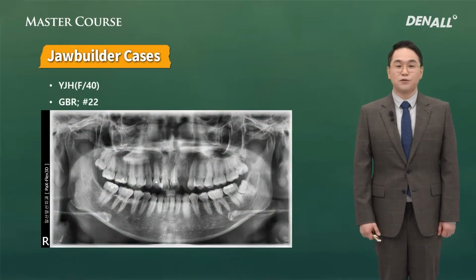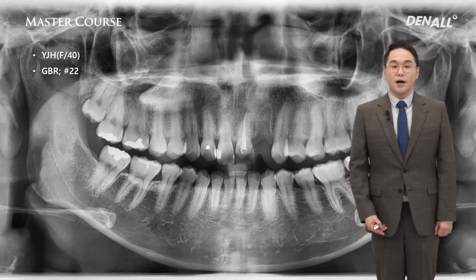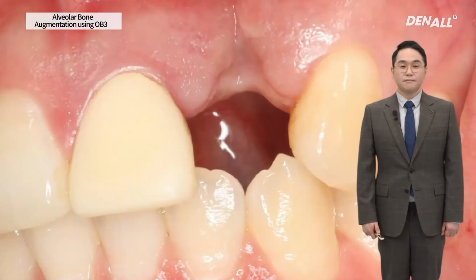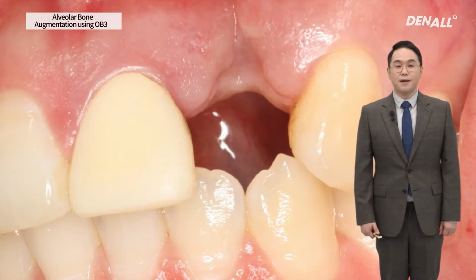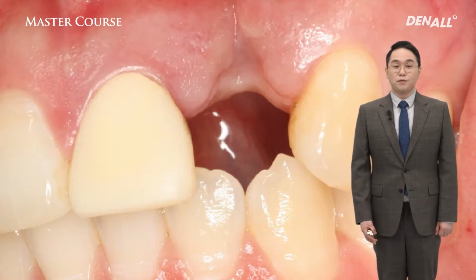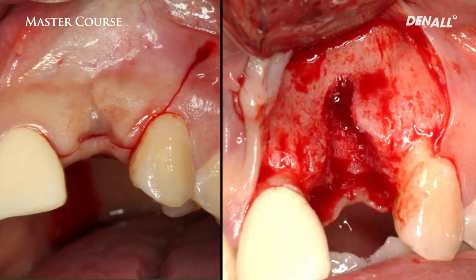A 40-year-old female, she had a traffic accident, so upper left incisor was extracted. Due to the trauma and the extraction, there is a severe labial bone resorption. Pre-op photo, as you can see, the adjacent teeth papilla looks okay, but labial bone plate is lost a little bit. So she wanted very highly aesthetic implant prosthesis, so we decided to use the delayed approach.